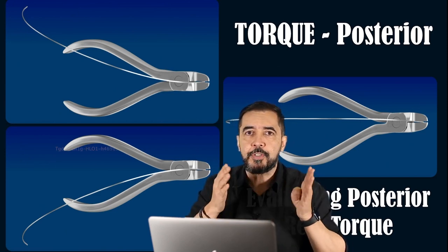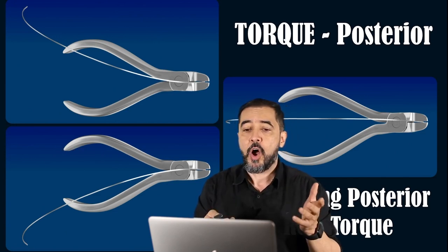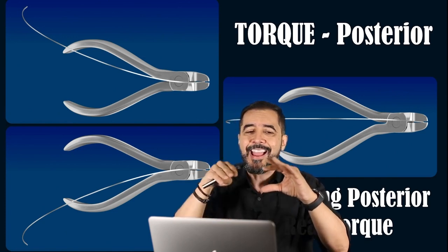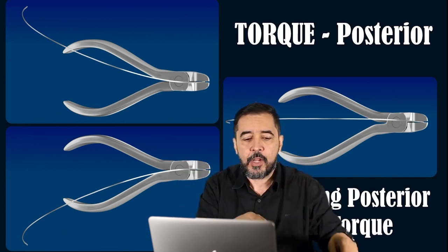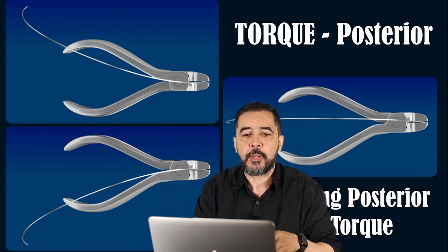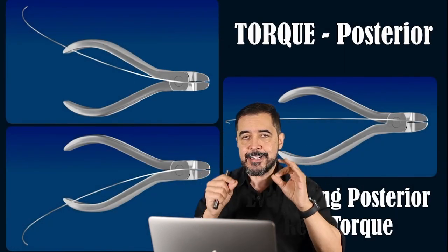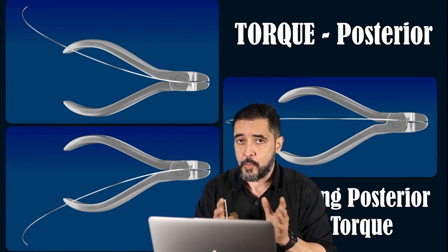I'm jumping a little bit ahead because I want you to understand that the most important thing here is to understand the relationship between the real torque, the real torsion of the segment of the arch wire that we are doing the torsion in, and the relation between that torsion and the inclination of the slot. We have the bracket, we have the slot, and we go inside the slot with this wire, and this relationship between the inclination, meaning torsion, of the rectangular arch wire and the inclination of the slot, this is what matters for us. But we have to understand the real torque.